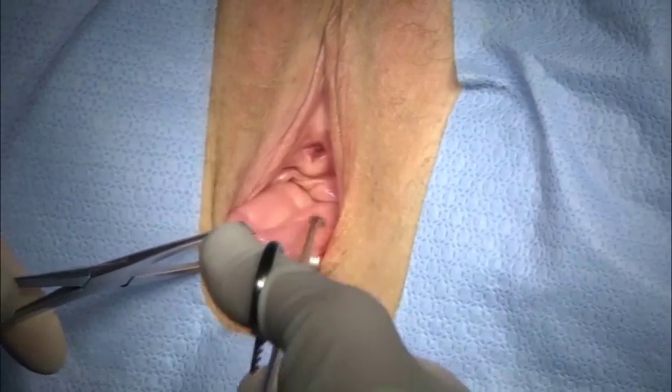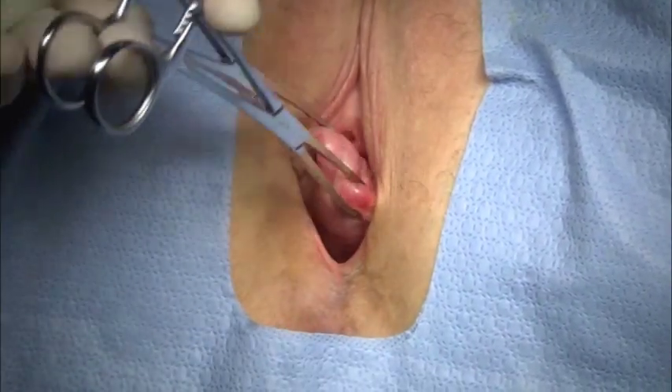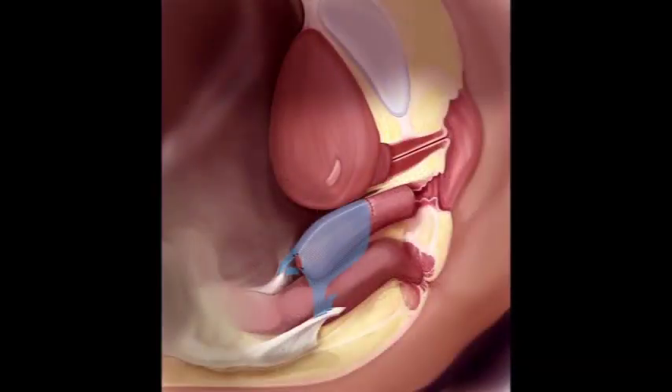This 65-year-old patient presented with post-hysterectomy vault prolapse. After careful counseling, this patient opted for an augmented repair and considered both abdominal and vaginal approaches. She subsequently selected a transvaginal option.